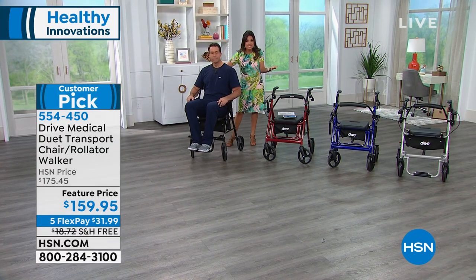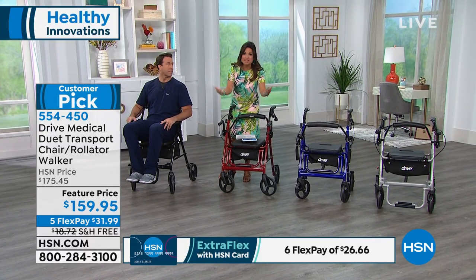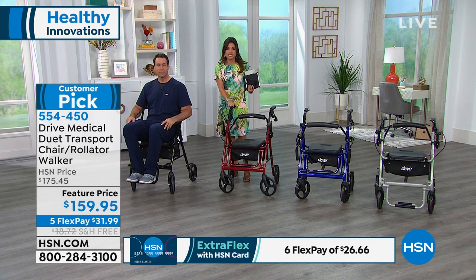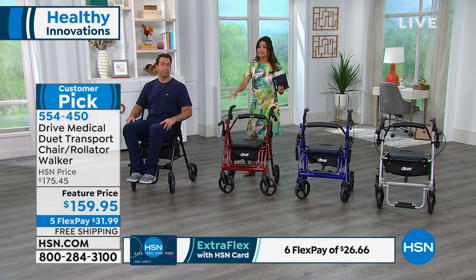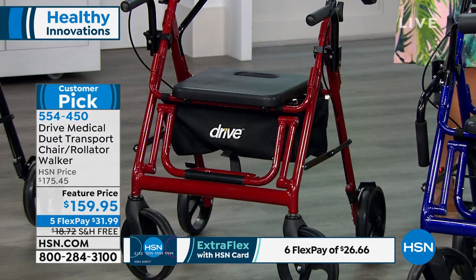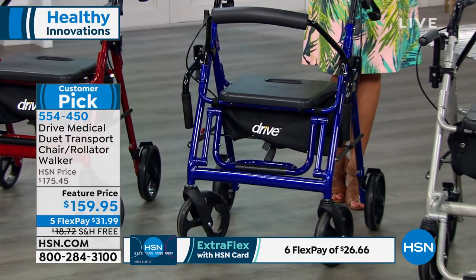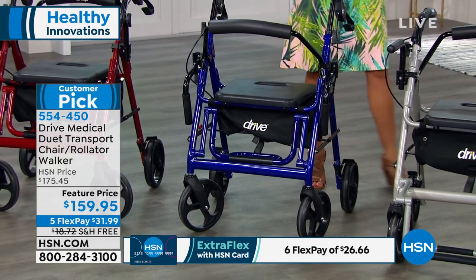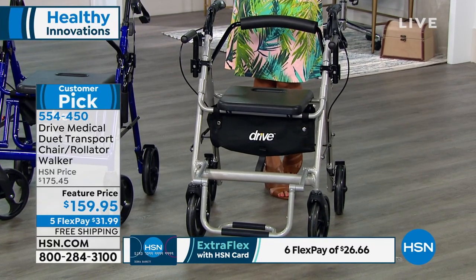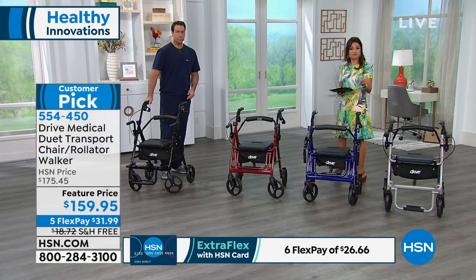It's the freedom you get, the confidence, with the quality of a brand like Drive Medical and a limited lifetime warranty. The colors are just an added bonus — a fun way to express yourself. We've been using the black, we also have the great burgundy with about 50 left, a beautiful blue with about 150, and the silver. No matter what color you're choosing, you're going to get this at a feature price point — we've taken $15 off, so it's $159.95.